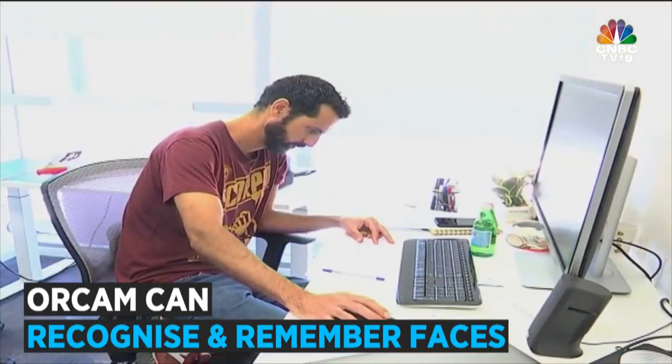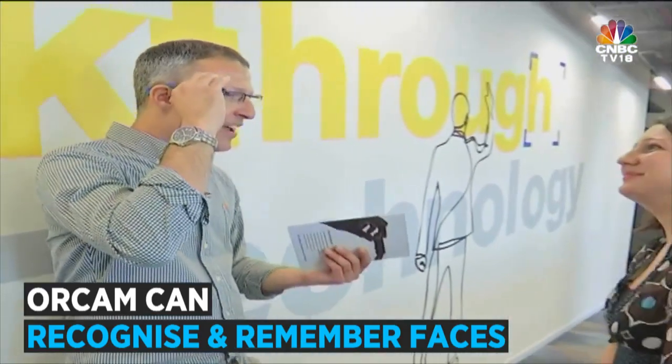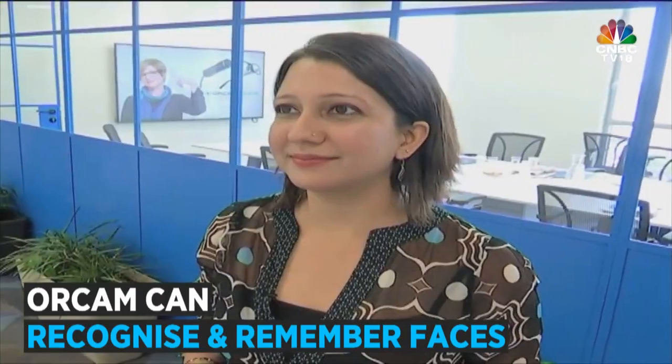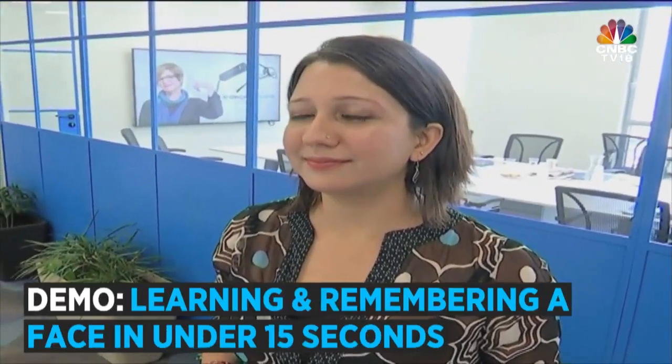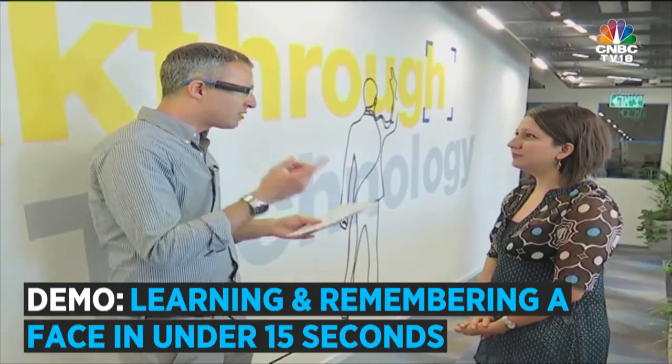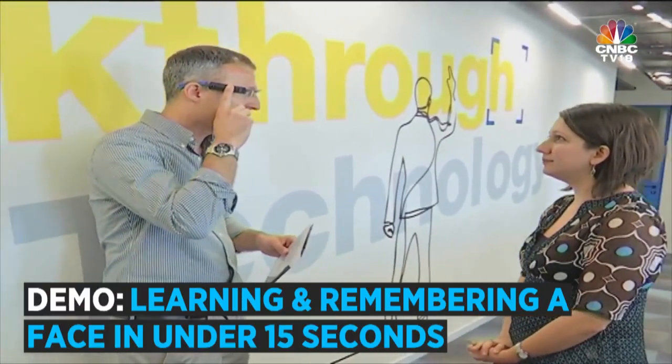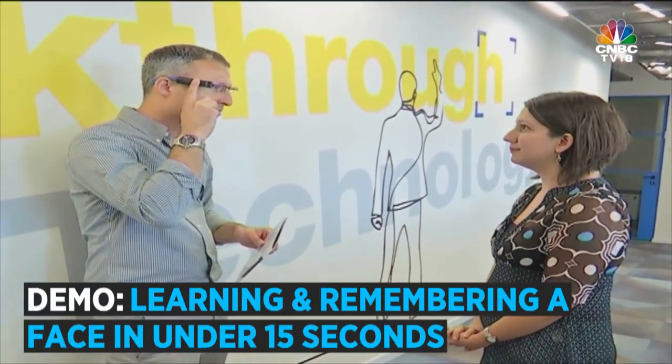So I can show you one of those, which is facial recognition. Okay. So with faces, I use my finger to point to text, but I'm not going to point at you, that's kind of rude, so I'm going to tap the side of my device, and we'll hear what OrCam has to say. A woman is in front of you. A woman is in front of me. So now I'm going to program your name, Saina, into OrCam. So I'm going to keep my finger on the side of the device and just look at you, and you'll hear what happens.